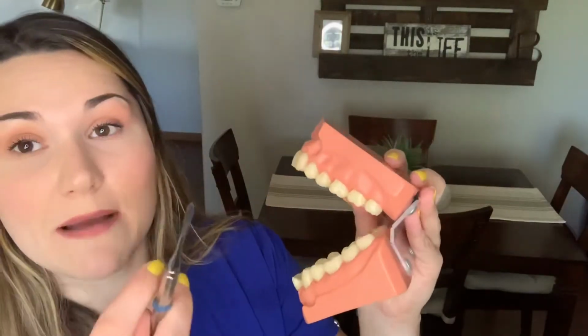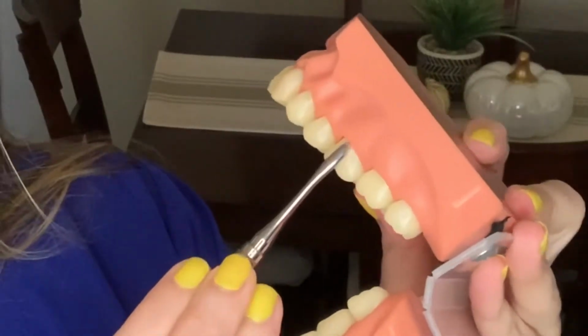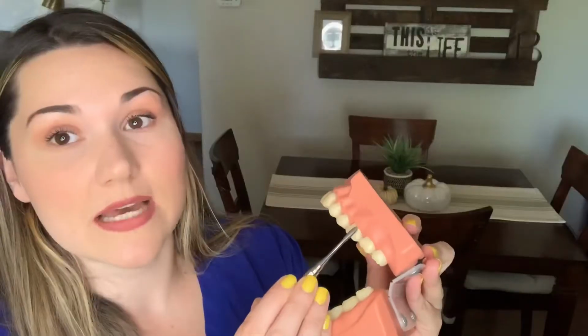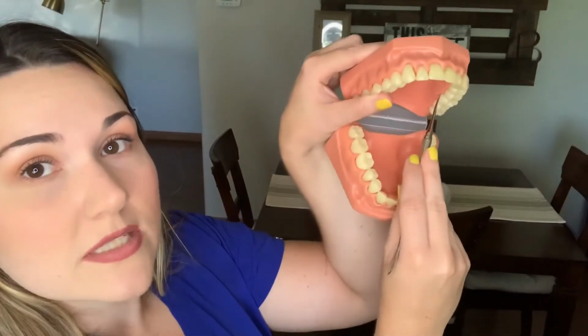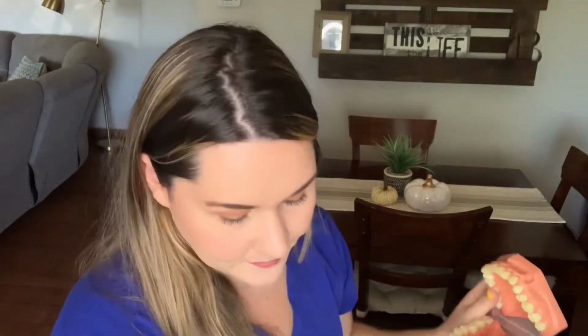So my dentist starts with a periostal. Now this is how he tests if the patient is feeling numb. So let's say we are extracting number 14. So he'll grab this and he will just push around the gum tissue like this. And he'll ask the patient, does that hurt? Is that bothering you? He'll go in here, push around the gum tissue. You know, does that hurt? And then as long as the patient says no, that they don't feel anything, then he'll move on.